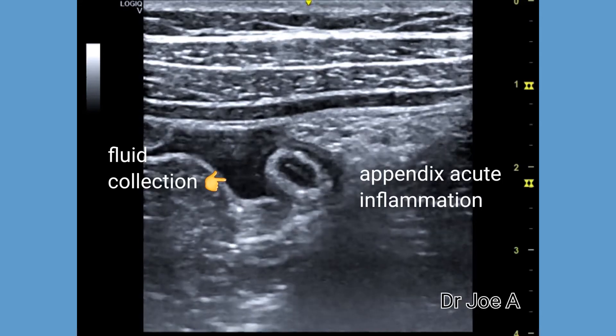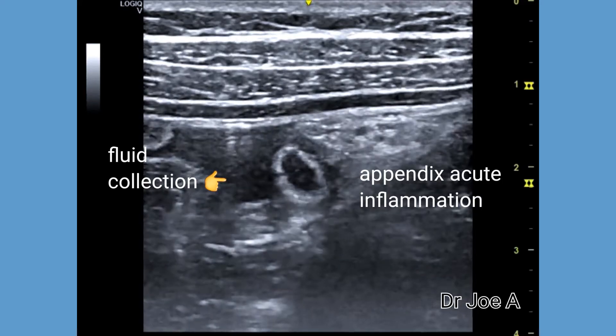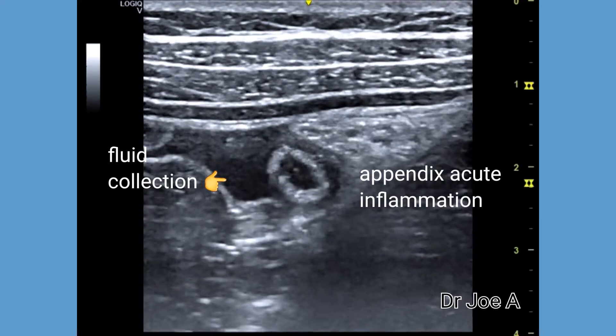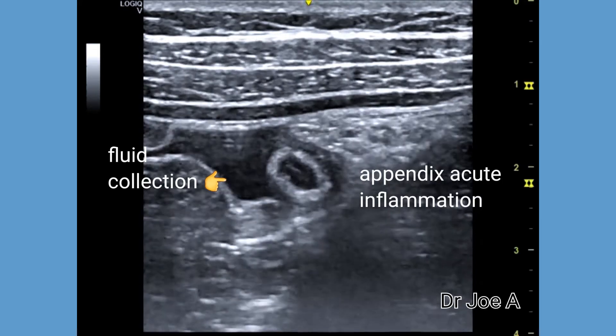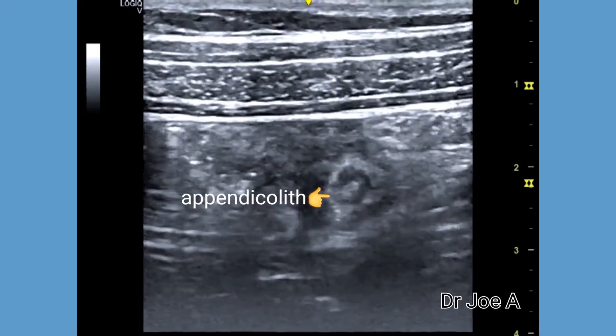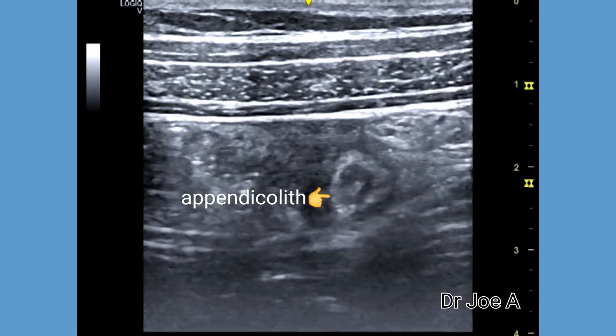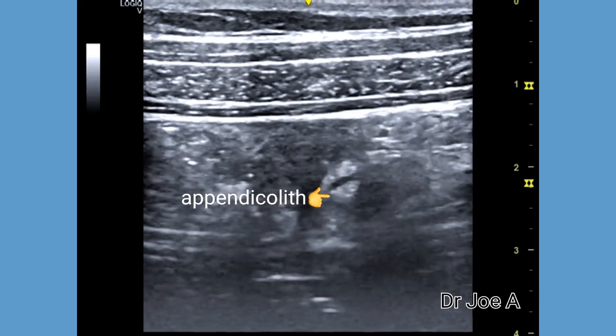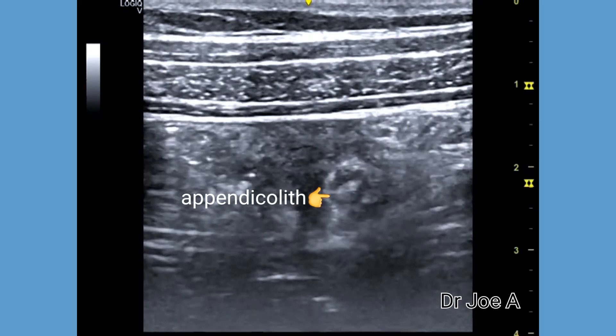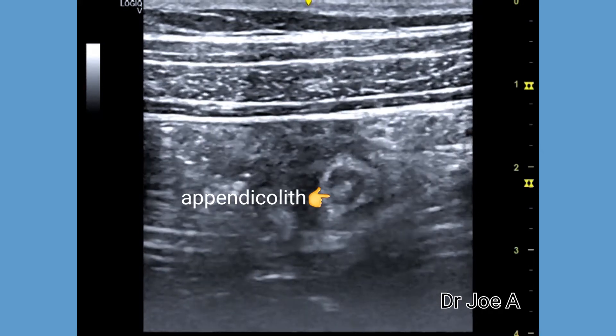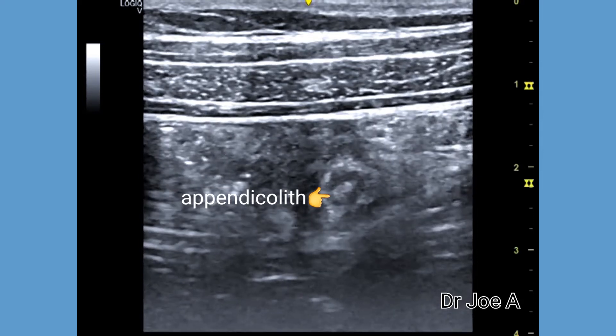Note also the presence of calcified fecal matter within the appendicular lumen — an appendicolith — within the appendix.